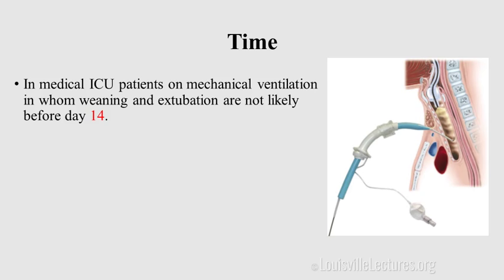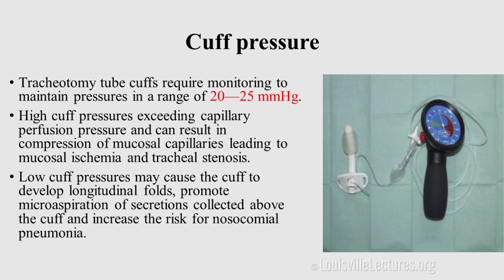After that, a meta-analysis came out showing maybe there is a benefit. But as for now, with current practice, if you expect the patient to be on the ventilator more than 14 days, you can do a tracheostomy considering other factors as well. That's how we do the trach at the bedside by dilational tracheostomy, and we do it with bronchoscopic guidance.